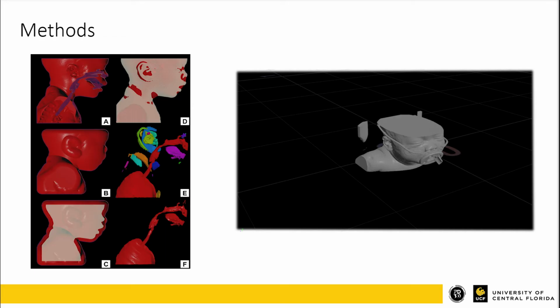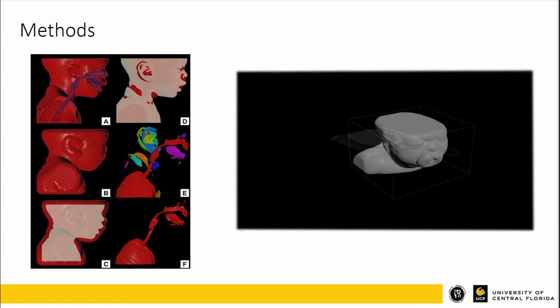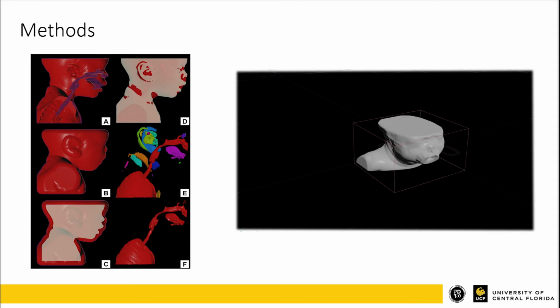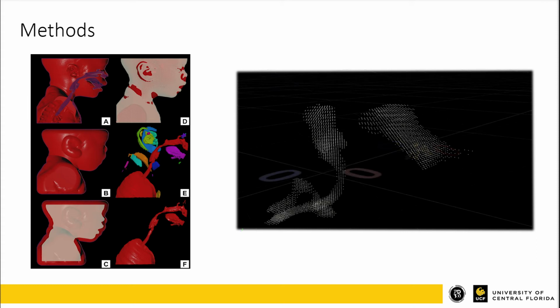Our method for designing the blades was by obtaining anonymous CT scans of 15 pediatric patients. The procedure for each patient followed the same pattern, which included the software Houdini to read and reconstruct the patient from the DICOM files of the CT scans, and to then isolate the airway passage automatically. Using the extracted airway passage, build paths were created to construct a 3D model of the blade for fabrication.